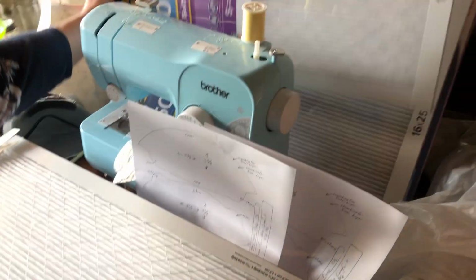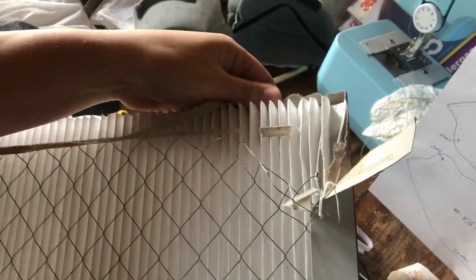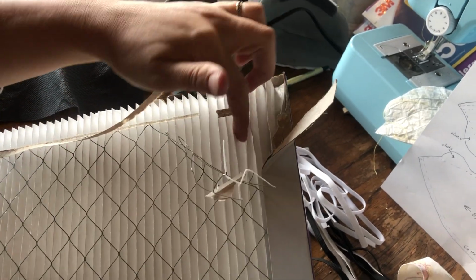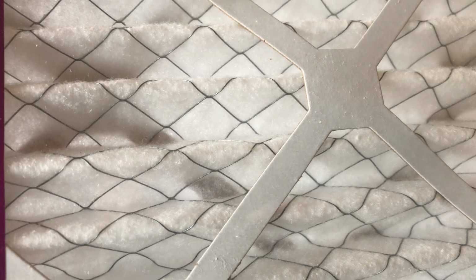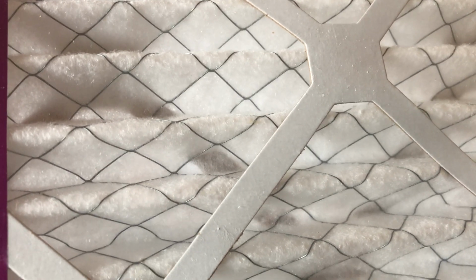I've got one here that I started to delaminate so I can show that it's really quite easy to pull these apart. They're hot glued along the edges. This is laying over the top. Now there's another kind of filter where the wire mesh is running in and out of the filter. I've got one here actually. I'm saving this filter in case I run out of everything else, but this one's going to be harder to pull apart. I don't know how well it's going to come apart. So we'll see what happens if I have to get to that one later.